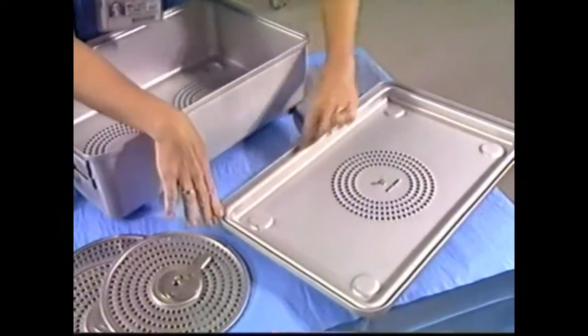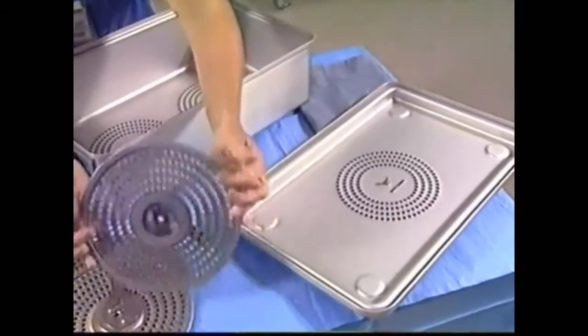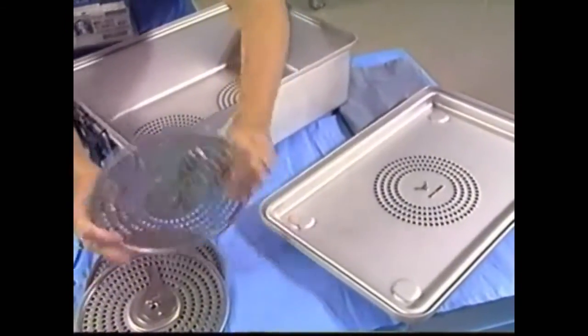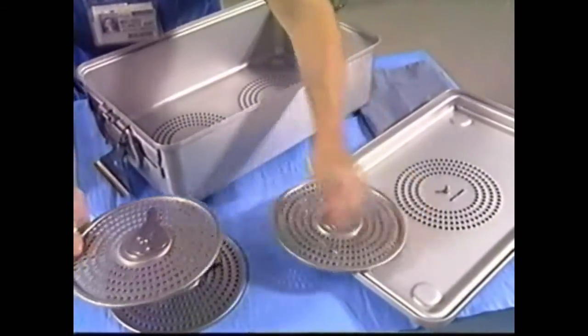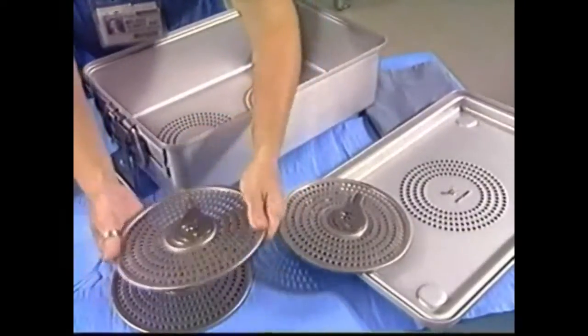Verify that gaskets in the lid and in the filter retention plate or plates are pliable, without cracks or tears, and that they are all properly and firmly affixed. If the retention plate is loose, adjust the tension by pressing downward along the perimeter of the plate.